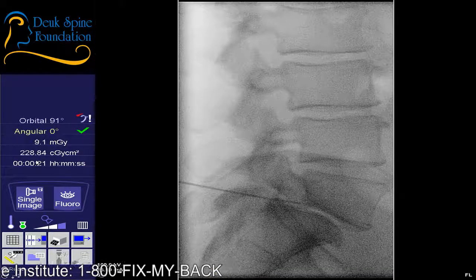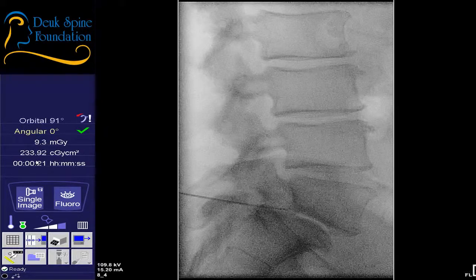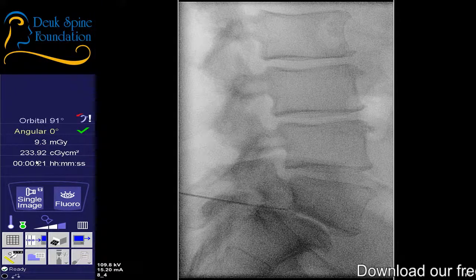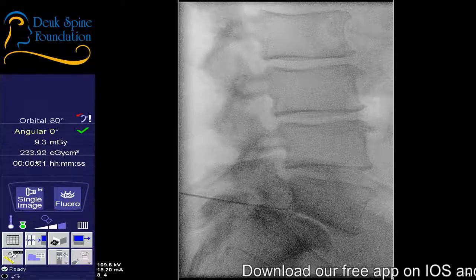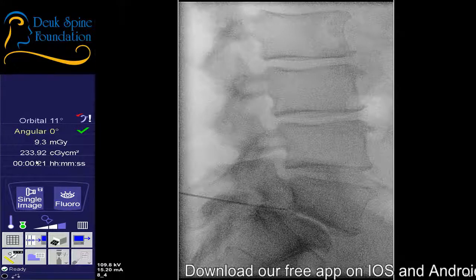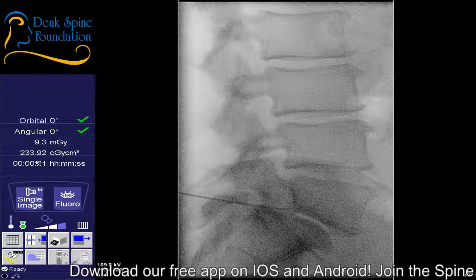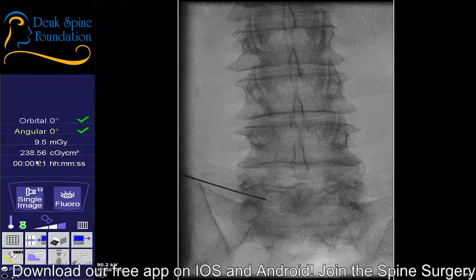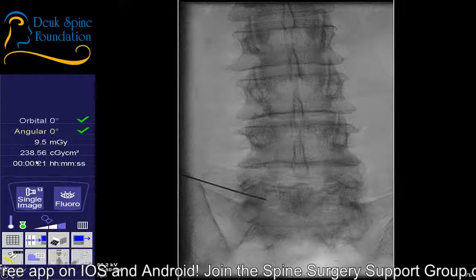How's he doing? All right, what was your question? A fracture of the pars? Yeah, there's a pars fracture. I believe there's a pars fracture, yeah. We call it a pars defect. It is a fracture, though, for the most part. That's what it is. All right, that's good. Back to a lateral.